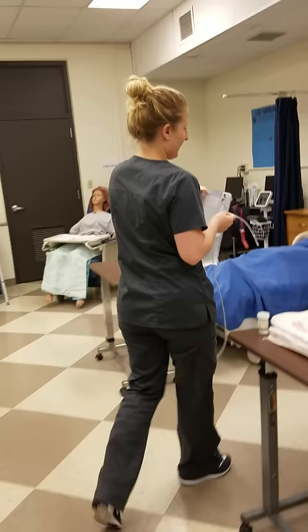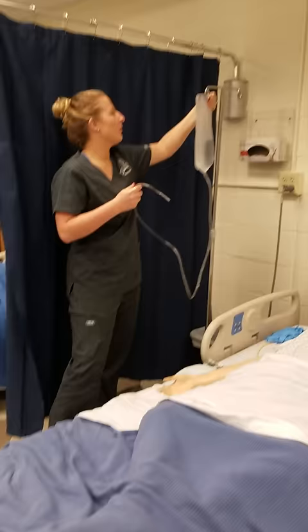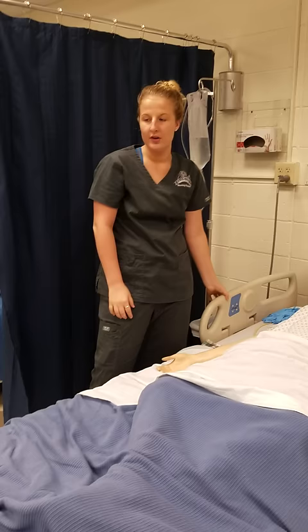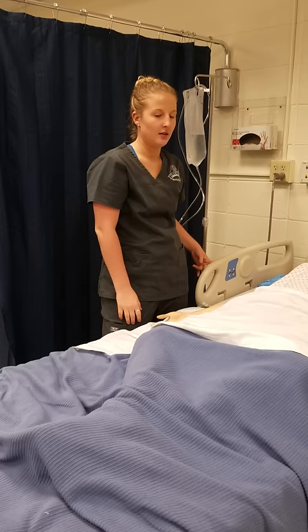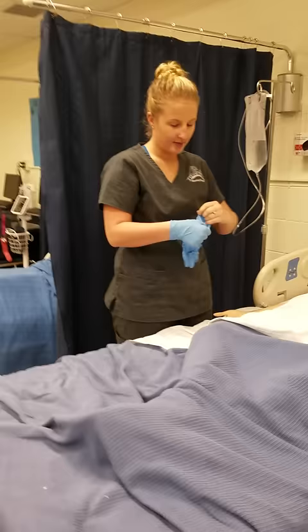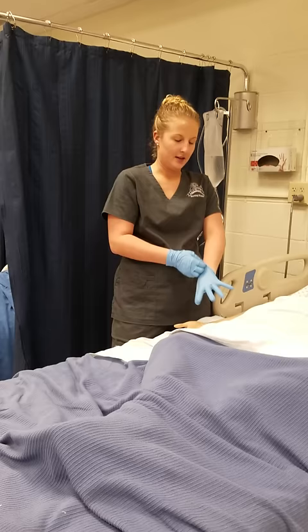I'm going to hang it on my IV pole. I'm going to introduce myself to my patient, check two patient identifiers and check my order. I will perform hand hygiene and place clean gloves on. I will assess my patient's abdomen for tenderness and see if it is distended. I will ask them when their last bowel movement was and the consistency, color, and amount.